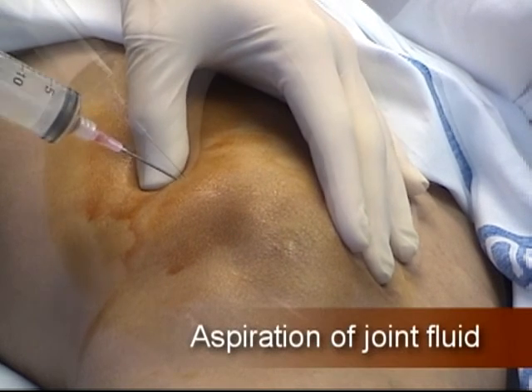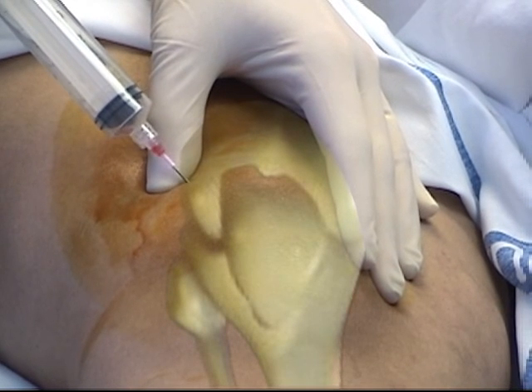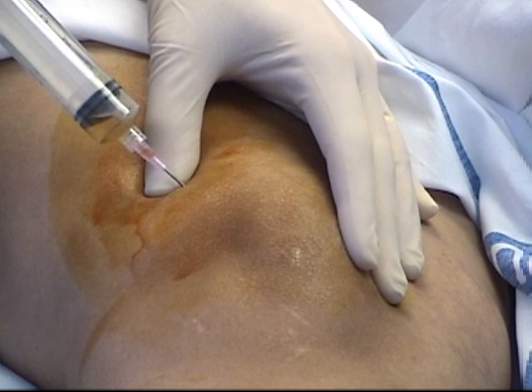Pass the needle through the skin and into the palpable effusion. Compress the medial aspect of the knee joint with the opposite hand to push the intraarticular fluid toward the needle and stabilize the skin for penetration by the needle.